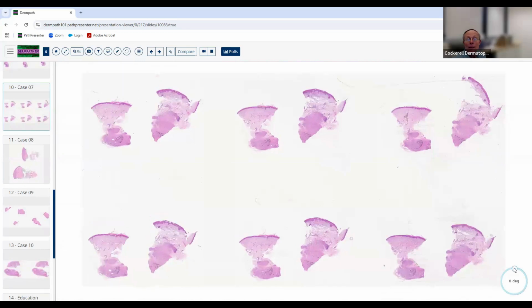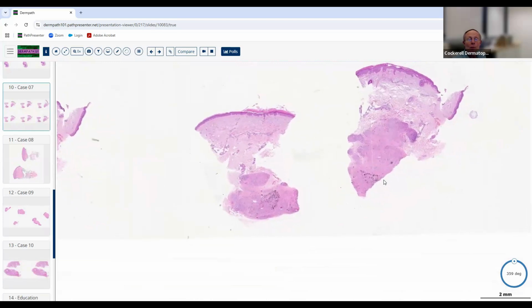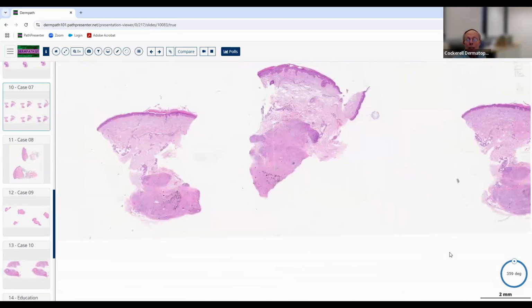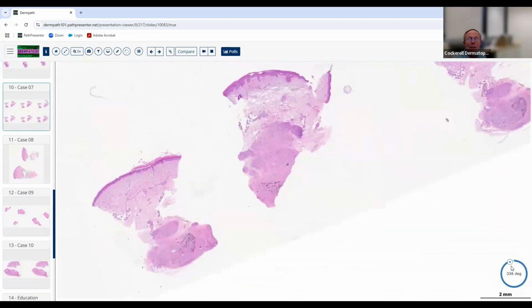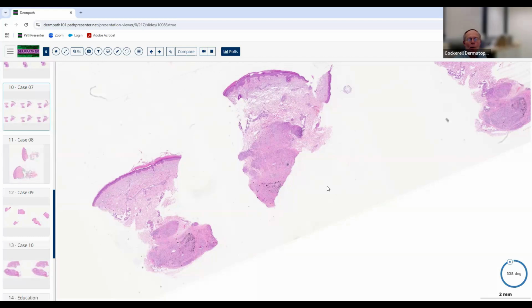Another example here of a punch biopsy. And we'll take a look at maybe these two pieces over here. This one's actually got a nice clue to it. There's something going on down in this area here, and we see these nodular aggregations of these pale staining cells. So theoretically it could be a neoplasm, but maybe it's an inflammatory process with these nodular aggregations of histiocytes in the dermis. It's more likely to be an inflammatory process when it's got nodular aggregations of histiocytes like this. We think it might be a granulomatous inflammatory process.